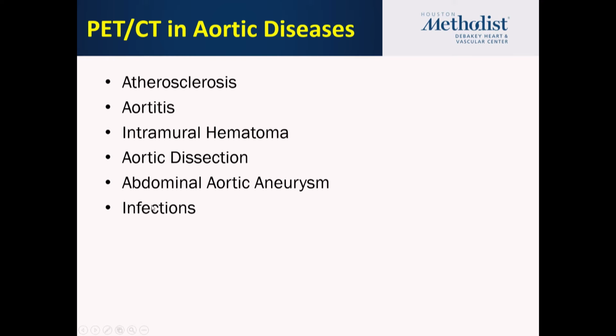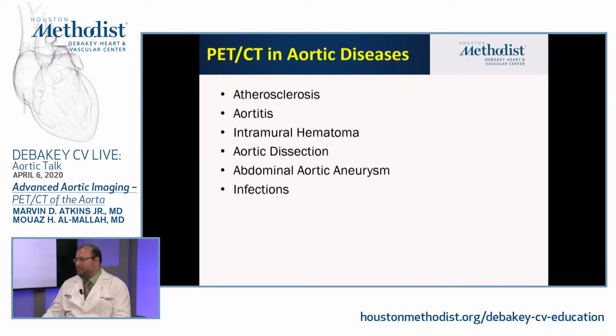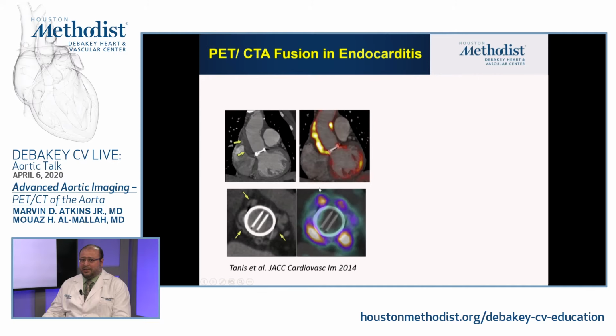Finally, this is where I think it is probably the most validated clinically, which is looking at infection. Because in infection, now you have a collection of inflammatory cells. So there is a mega inflammatory response in there, so it's not minor. And PET has been used to look for potential infections in patients with fever of unknown origin for a long time. Right. And we started also to look at it in the heart itself.